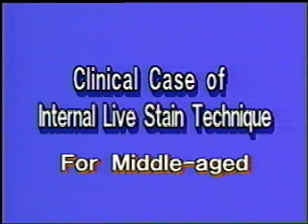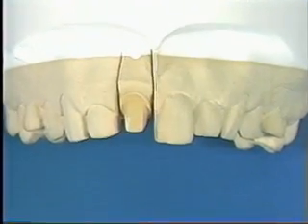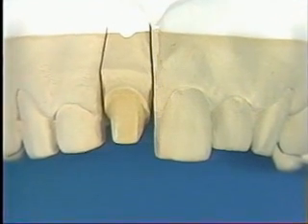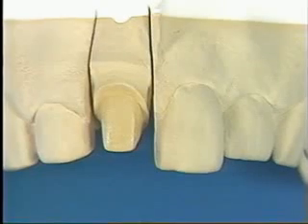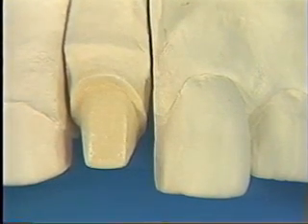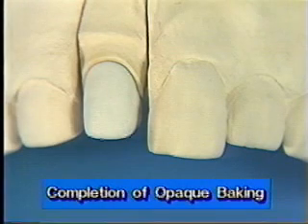Now let's review the clinical cases of internal stain technique. This case shows the shade reflection of a middle-aged person. Fabricate the ceramo-metal crown for the maxillary central incisor. Then bake the opaque.